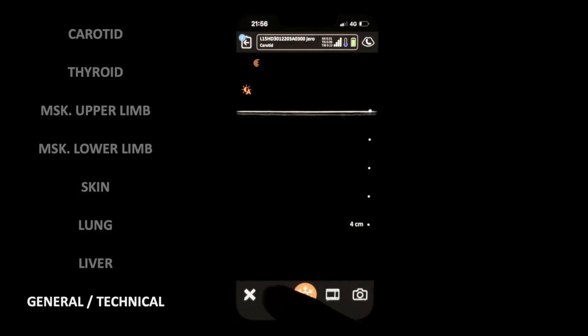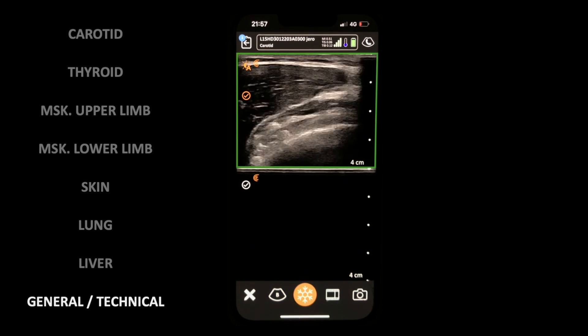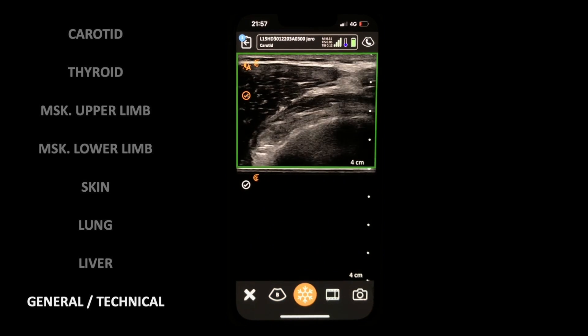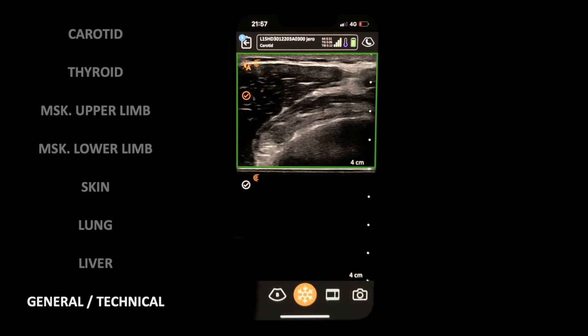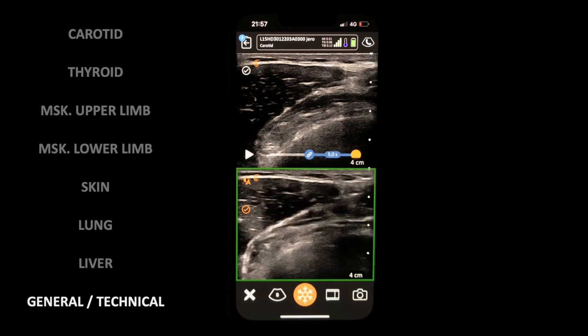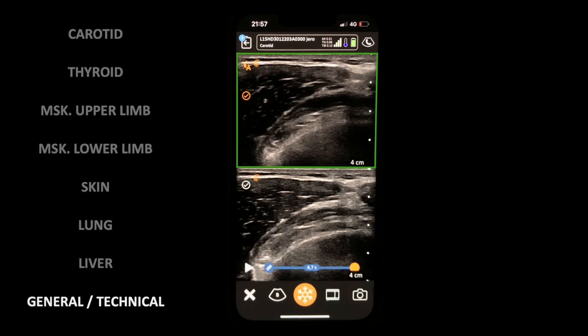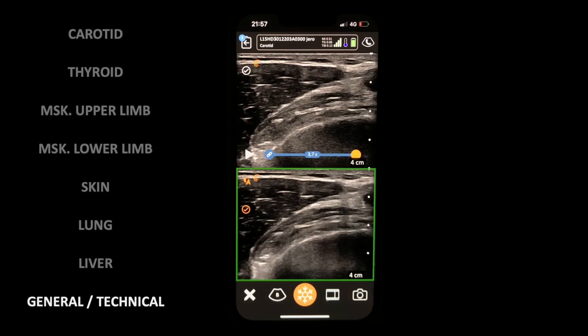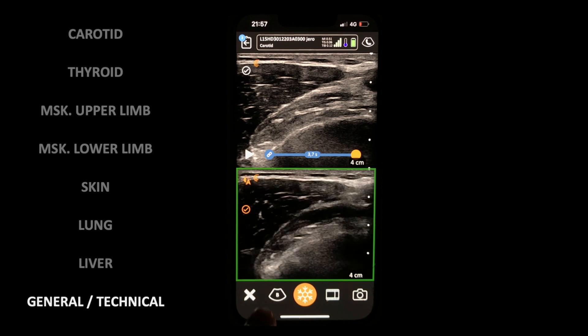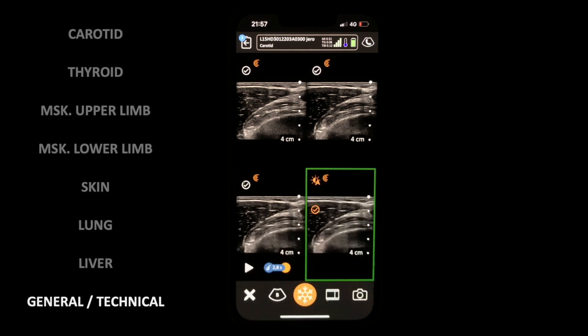I want to show you an advanced feature that from my experience is unique among handheld devices — more widespread among cart machines — and it's this split screen, where you can freeze an image on one half and continue scanning on the other to compare with the contralateral side, for example. You can switch between them in real time. Note the auto gain is switched on in these clips as well. You can even split the screen in four — of course this is more useful when used with bigger screens like an iPad.